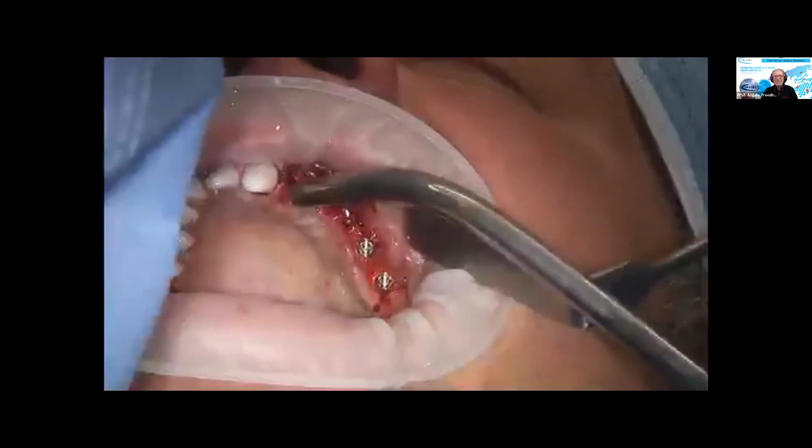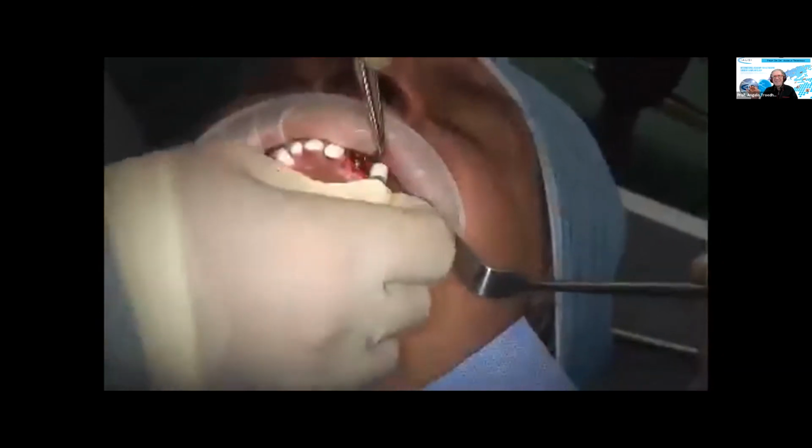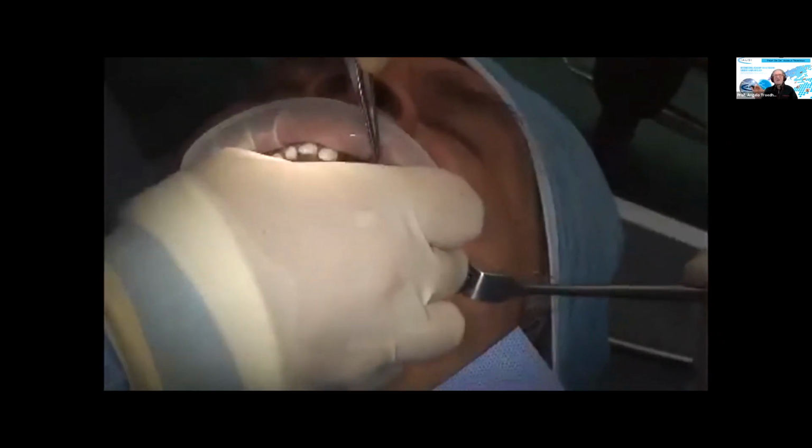And we did all this, the entire procedure, crest splitting with widening of the alveolar crest to 5 to 6 millimeters, plus a sinus lift of the entire sinus through a transcrestal approach without detaching the periosteum.